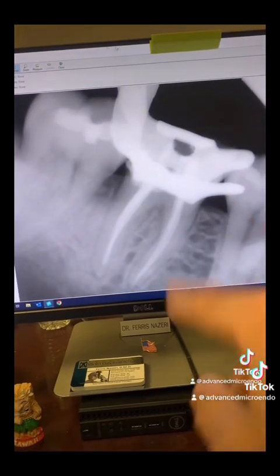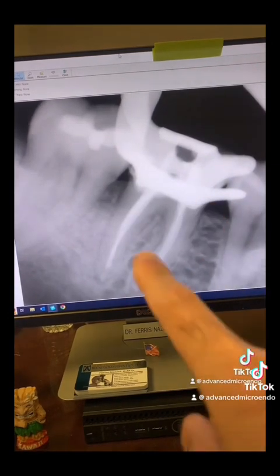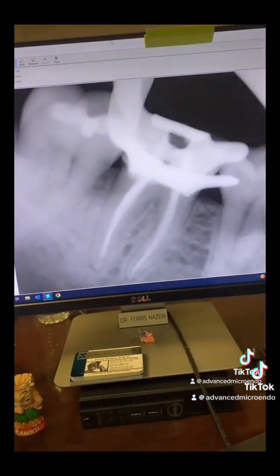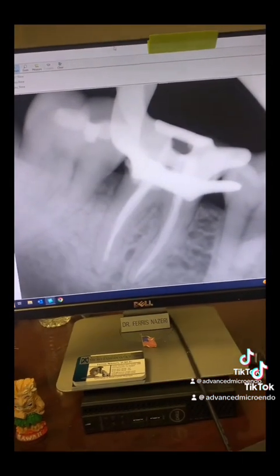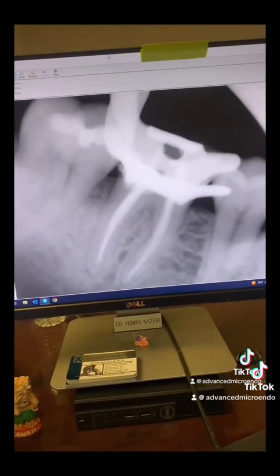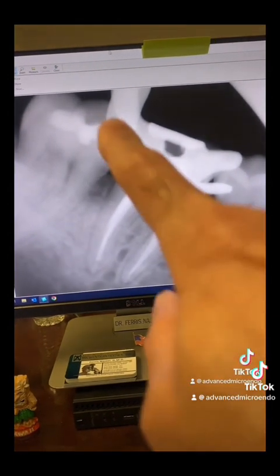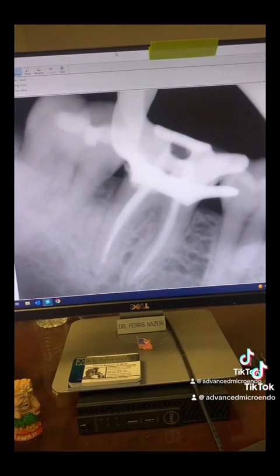And this PA looks like it's from post obturation. The dentist took an x-ray. I can see the rubber dam clamp. That's great, but unfortunately, again, no periapical radiolucency here. So this periapical radiolucency occurred after the root canal. So somehow bacteria got inside of the canals and caused the endodontic treatment to fail. Even though this dentist used a rubber dam, somehow microorganisms still got in.